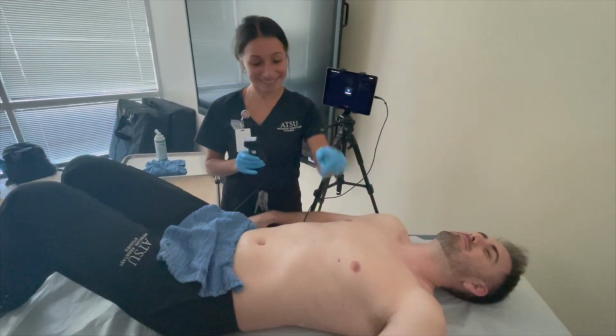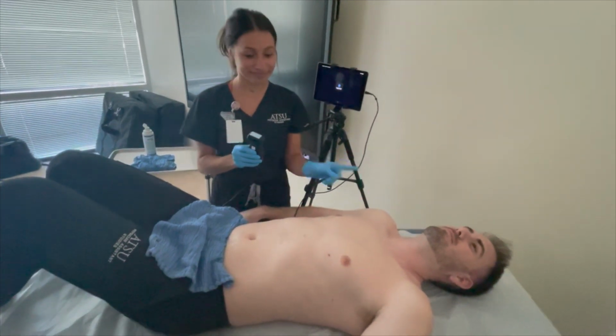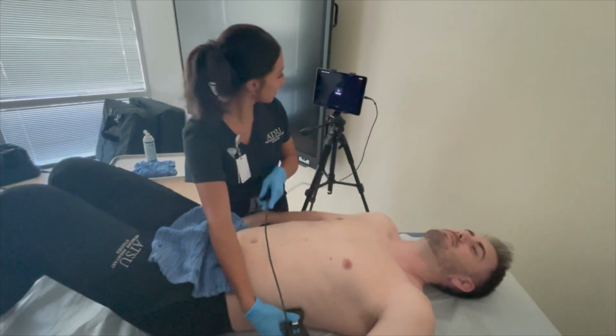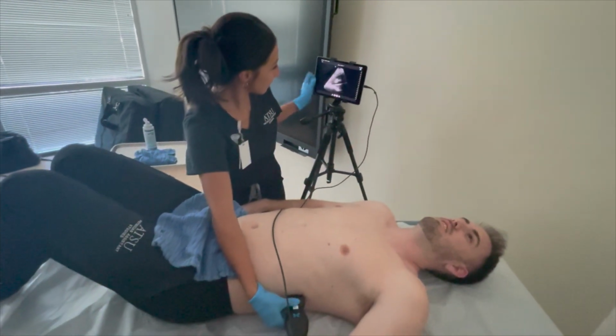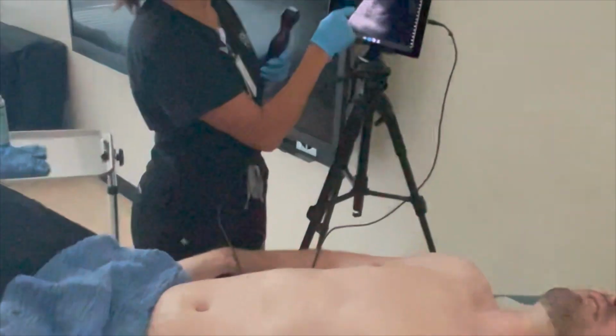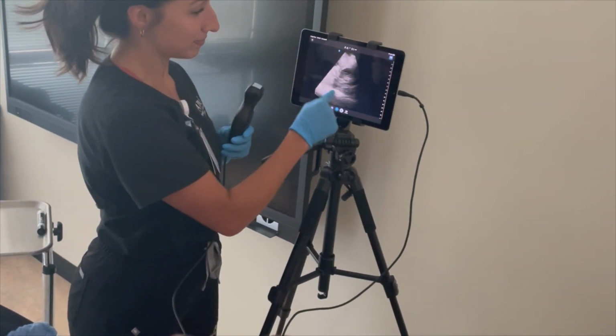In the left upper quadrant, indicator pointing towards the head of the patient, anchor the probe in the posterior axillary line around the 8th intercostal space. A tip is knuckles to the bed since the spleen is more posterior. This is used to identify the spleen, perisplenic space between the spleen and the diaphragm, and the left kidney.